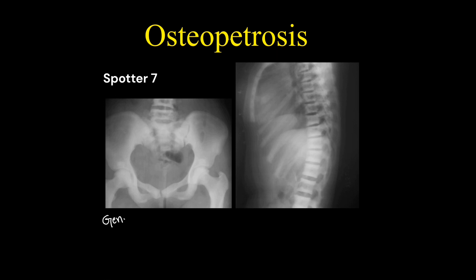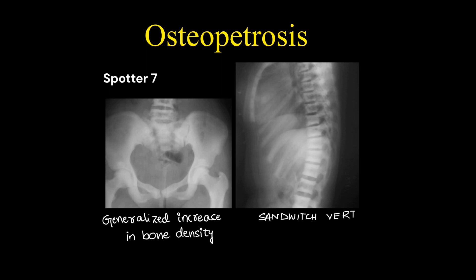In the case of osteopetrosis, there is a generalized increase in bone density and there is sandwich vertebrae seen, where there is diffuse end plate sclerosis.